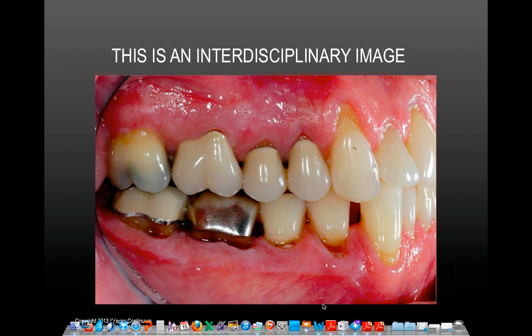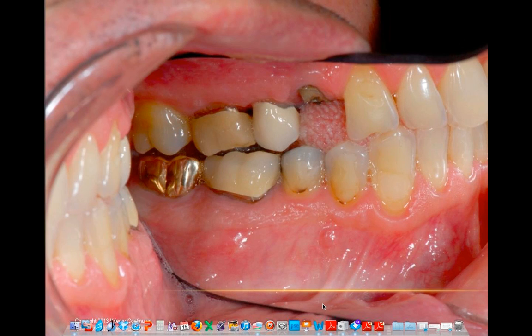On my blog, about, I don't know, 4 to 6 months ago, I had an article that talked about how to grade your images. And it's a nice thing to do. Go back every now and then with a piece of paper and a pen and grade and see what you've got and see if your grades are getting better. And if they're not, try to figure out why they're not. Now, if you're getting images that look like this, they're okay. You can crop them, but you really don't see soft tissue up above. But hey, this is a person who's picking up a camera and shooting an image. So kudos to them for trying and just get better.